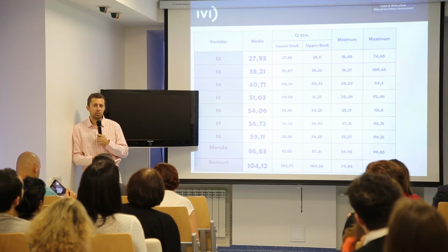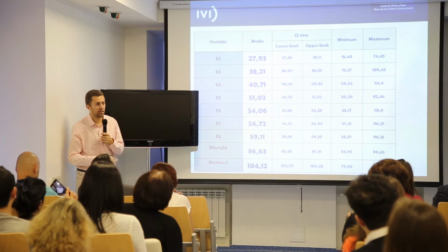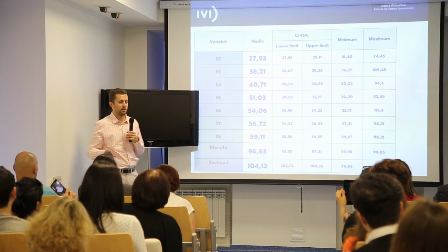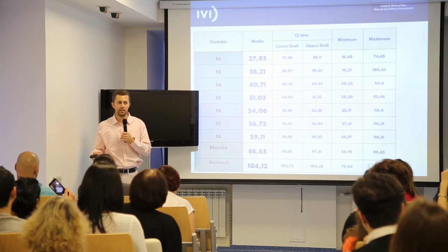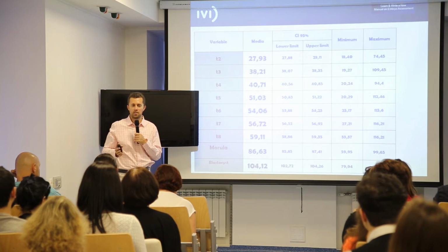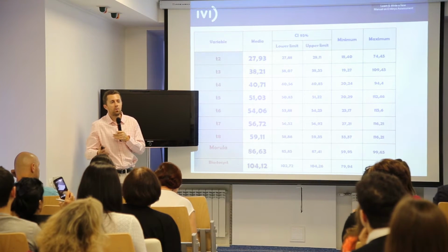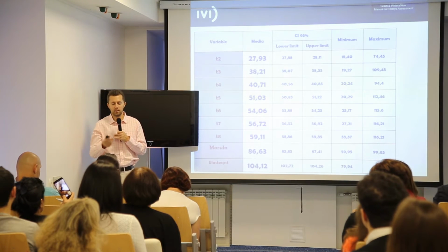One of the things you realize just by studying the embryos and analyzing tons of data is this: we observe our embryos in our lab in the morning because we work in the morning, right? It's not because of anything else. We go to work in the morning, but we don't go to work at night, right? So we have adapted our evaluation of the embryos to our working hours. But that potentially may not be the right thing, because maybe the main events of embryo development are happening when we are sleeping at home, okay? So let's think about what we are doing.